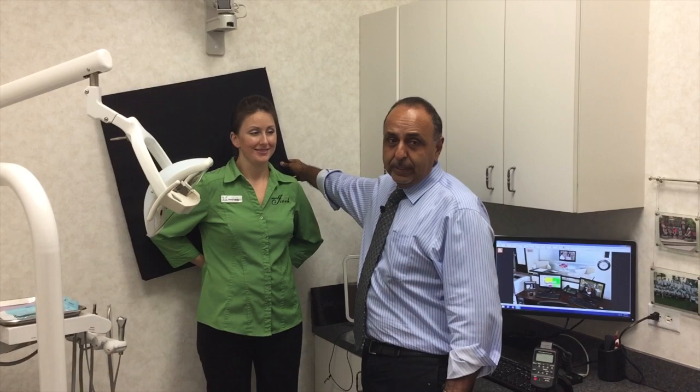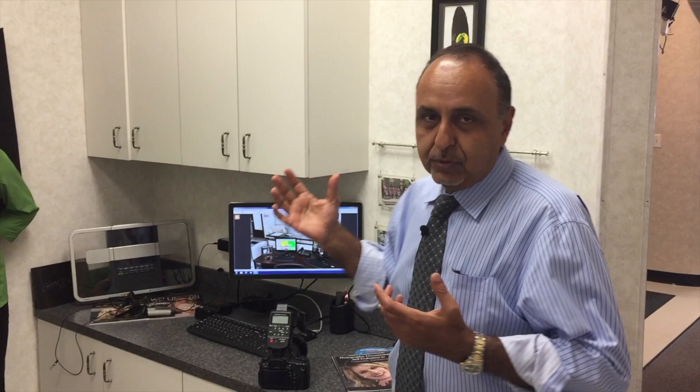The first shots we're going to take are portrait shots. Again, this is not a studio shot — this is just for diagnostic. We have a black background, which we usually use for patients with light or blonde hair because it blends into the wall. For patients with darker hair, we use the white wall. In the clinic we have a blue wall, which is great, but the flash makes it really shiny. So I take my shots at an angle in the clinic. Also, remove the bib — you don't want the bib in a portrait shot.